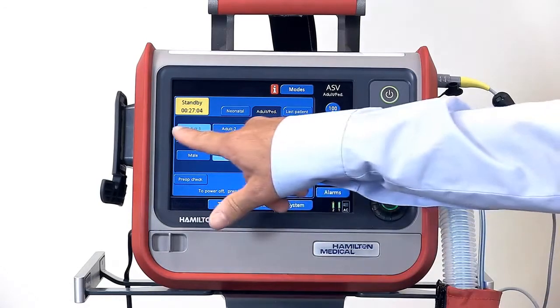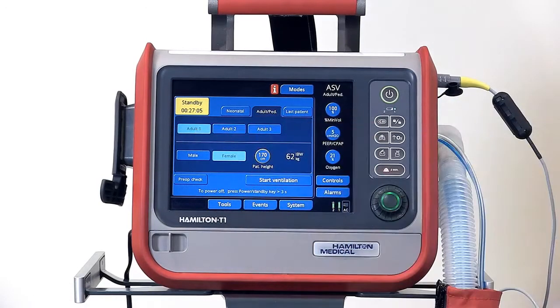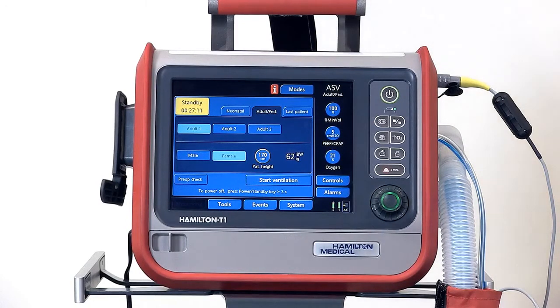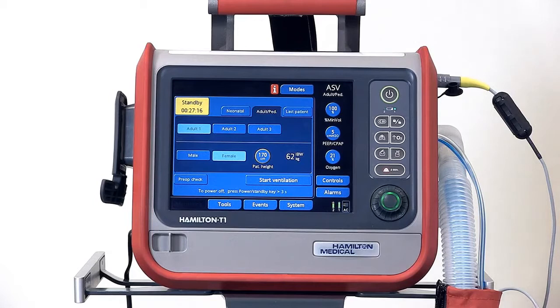In between are three configurable quick setup buttons for each patient group. A quick setup refers to a group of settings you define, including patient characteristics such as group and weight, mode selection, some control settings, alarm settings, and weaning zone limits.